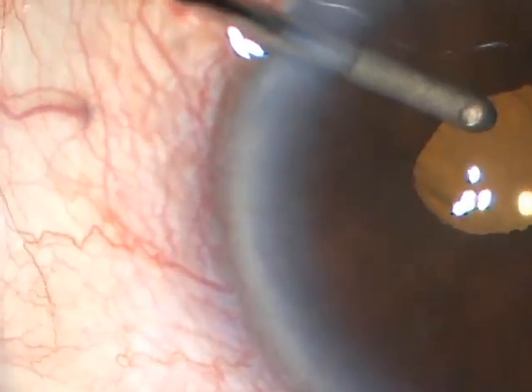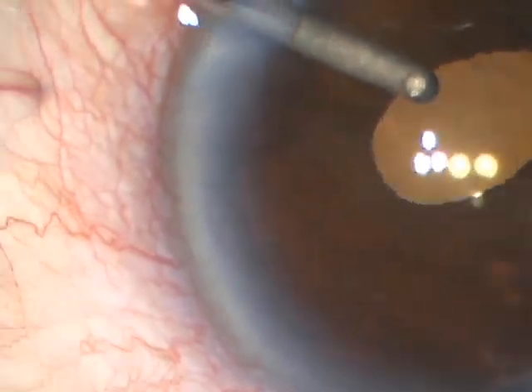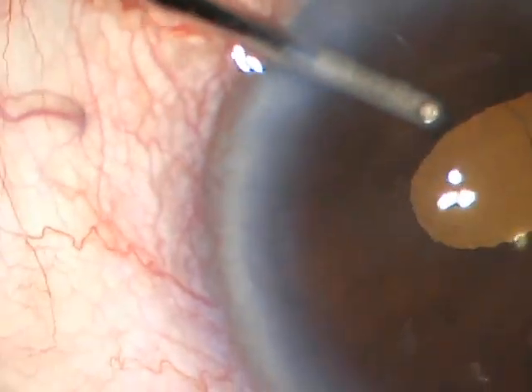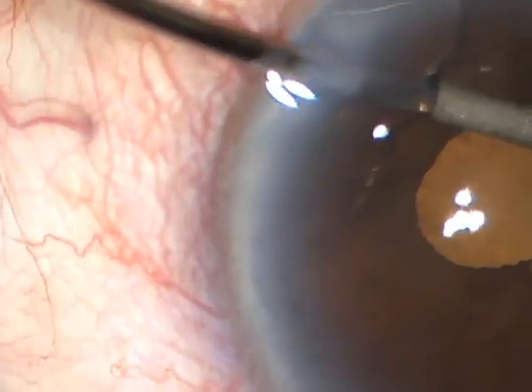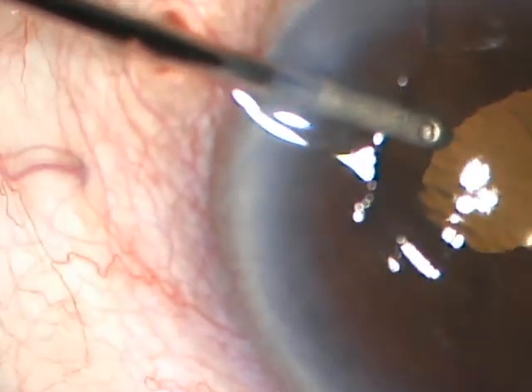and postoperatively the patient did not suffer any loss of endothelial cells or significant inflammation. Unfortunately, the cyst did recur, but we were able to re-inject it with ethanol at a later date with resolution of the cyst.